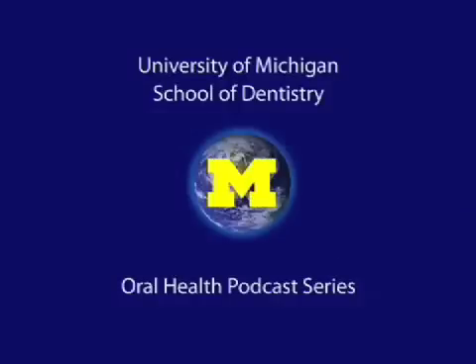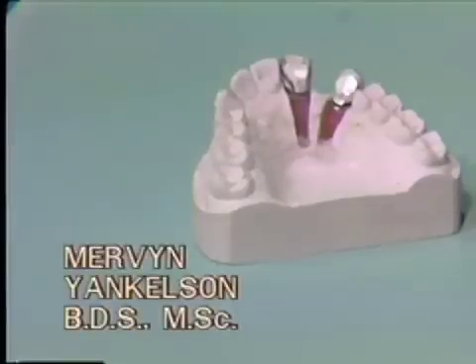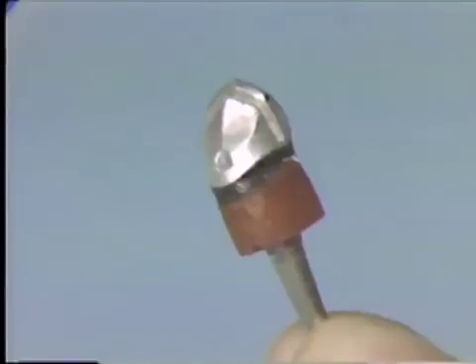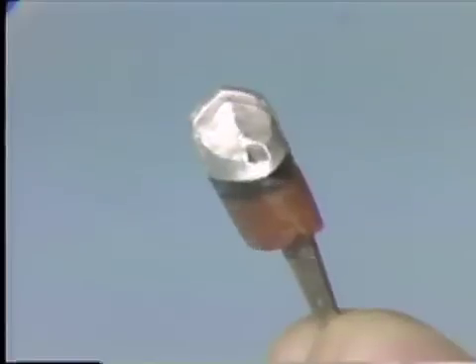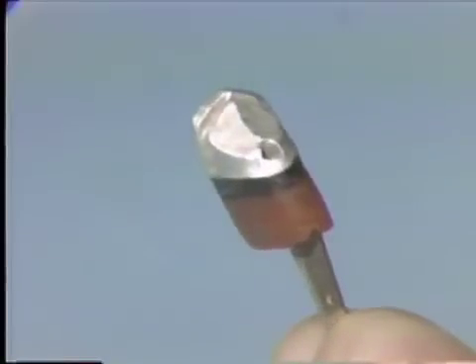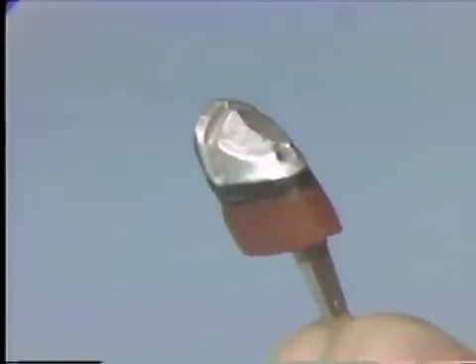Welcome to the University of Michigan Dentistry Podcast Series, promoting oral health care worldwide. The fabrication of an accurate and functional die requires the same care and attention to detail that is given to tooth preparation and the taking of an impression.